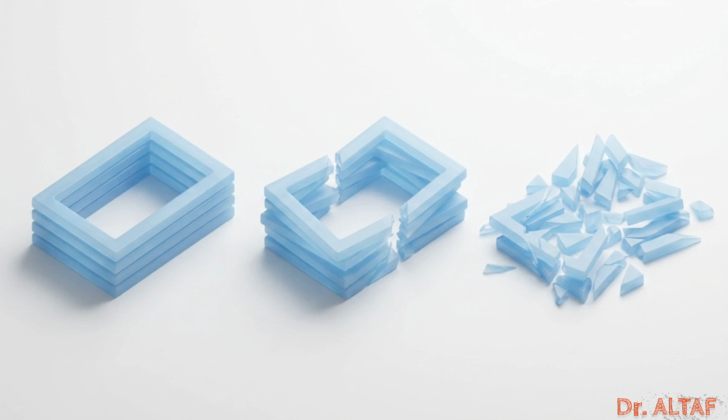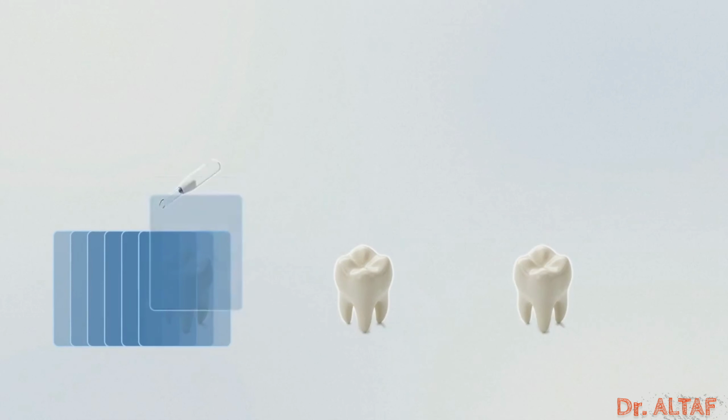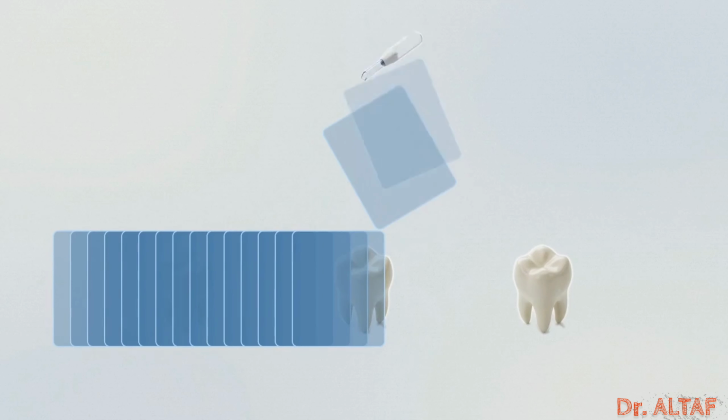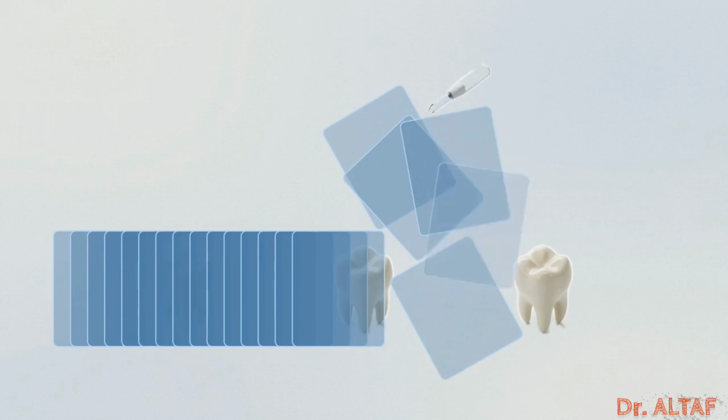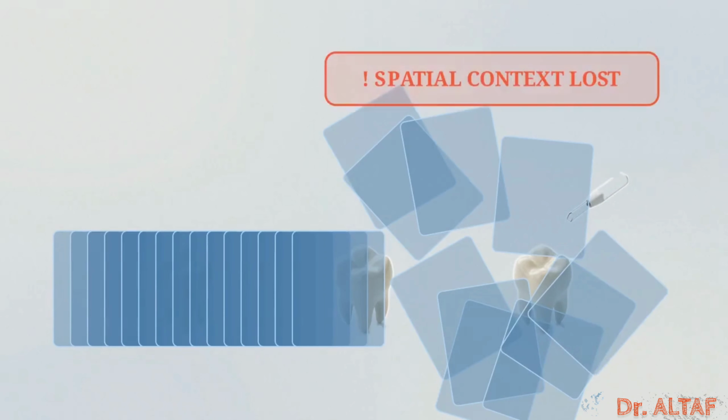Beyond environmental physics, the digital workflow is bound by algorithmic limitations, most notably path of acquisition errors. An IOS processes 3D space by capturing a rapid-fire stream of overlapping data frames, not a single photograph. If the clinician uses a poor scanning path or moves too quickly, the algorithm loses spatial context. The software artificially generates severe errors like rendering phantom teeth.